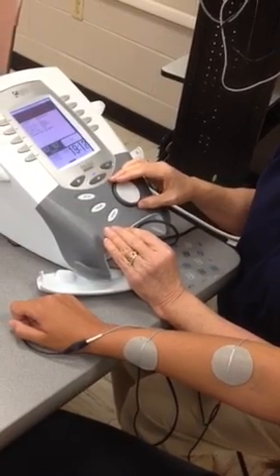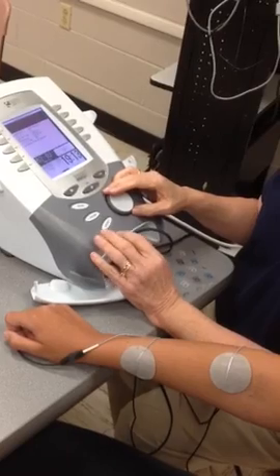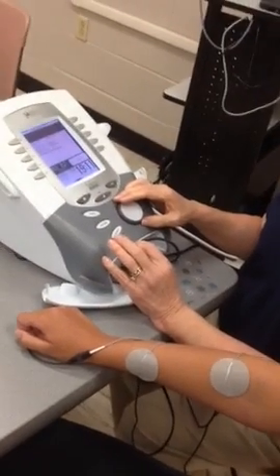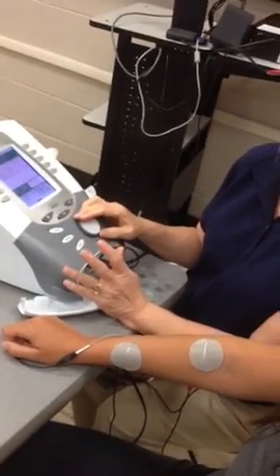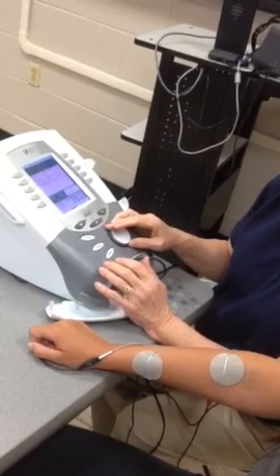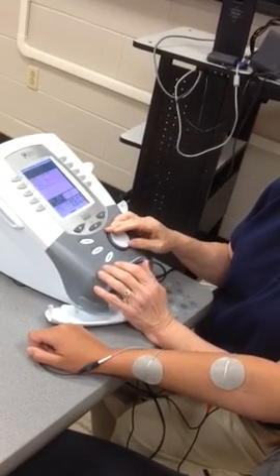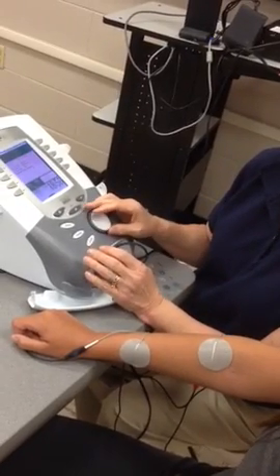All right, so I want you to tell me at what point, the highest point that you can tolerate that's comfortable. Okay. And is it sort of pulsing? Yes. Okay. That's what it should feel like.